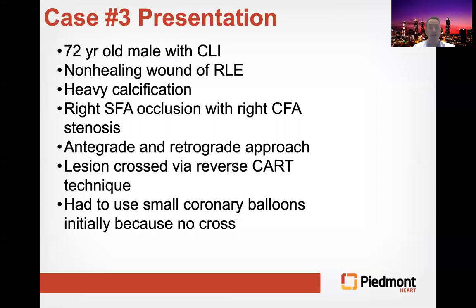The third case, looking at technical aspects of common femoral endovascular intervention, is a 72-year-old patient who presented with a non-healing wound, class 5. With heavy calcification, the right SFA was occluded with a right CFA high-grade stenosis. This was a very challenging case. It was performed by antegrade and retrograde.